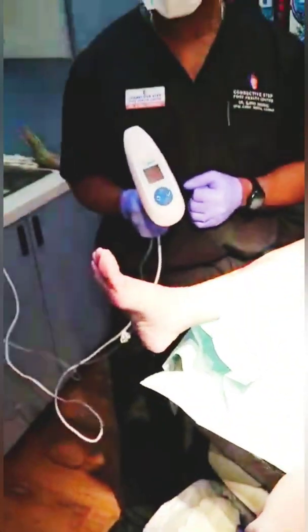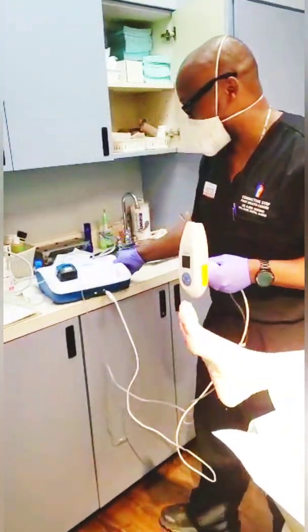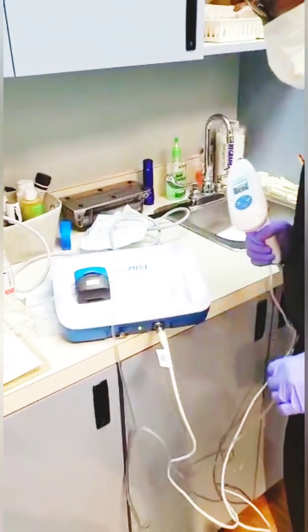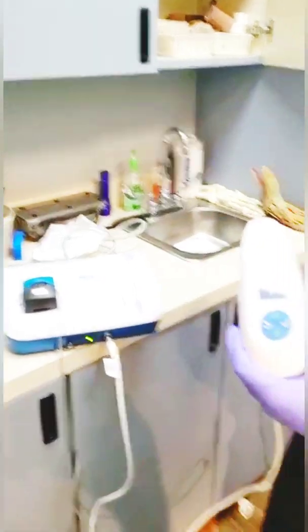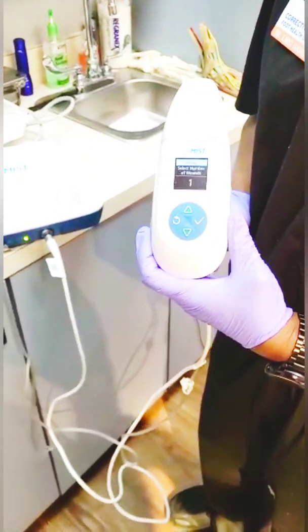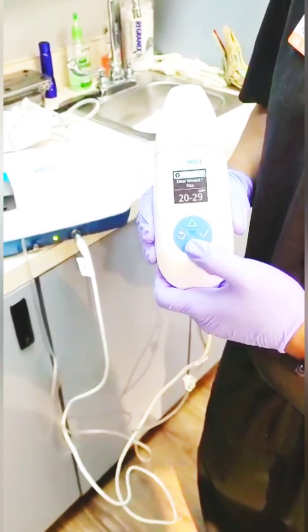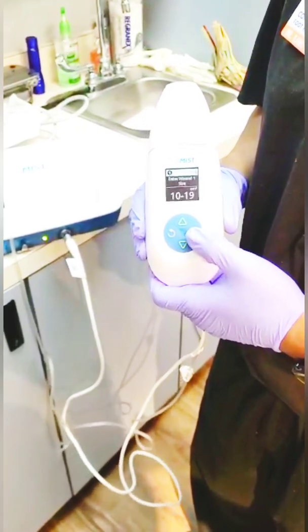Our wonderful rep has set everything up so I can look intelligent and smart. I'm going to turn on the machine — you can see the device right here. It comes in this handy handheld portable device and it even has little rolling carts. We have the technology on the screen right there. We have a number of wounds and we check-mark that we have one wound.